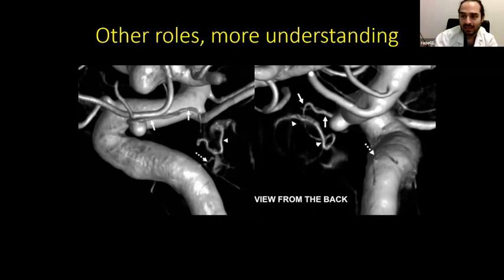But why do we call it like that? We call it like that because we know that a superior hypophyseal artery should come from it, but we are never able to see that, except when we do this imaging. And there it is, an example showing the superior hypophyseal artery coming from it. This is an example of many. It's a regular result that for superior hypophyseal artery aneurysms, when you do this imaging, you do see the superior hypophyseal artery coming from it.